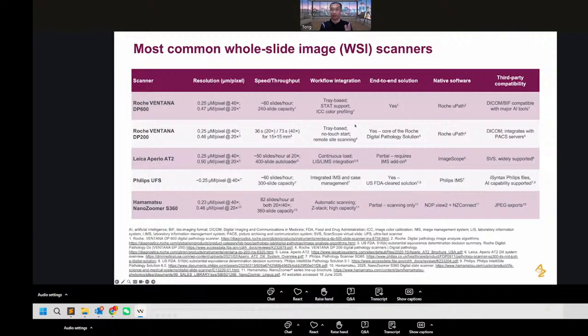Plus, this big data will transfer through your network to the cloud, because you don't have enough local storage. You have to upload it to a cloud, so those are the bandwidth and infrastructure needs. It totally changes things. It impacts the overall infrastructure, plus the FTEs. That's why the upfront cost is very high.